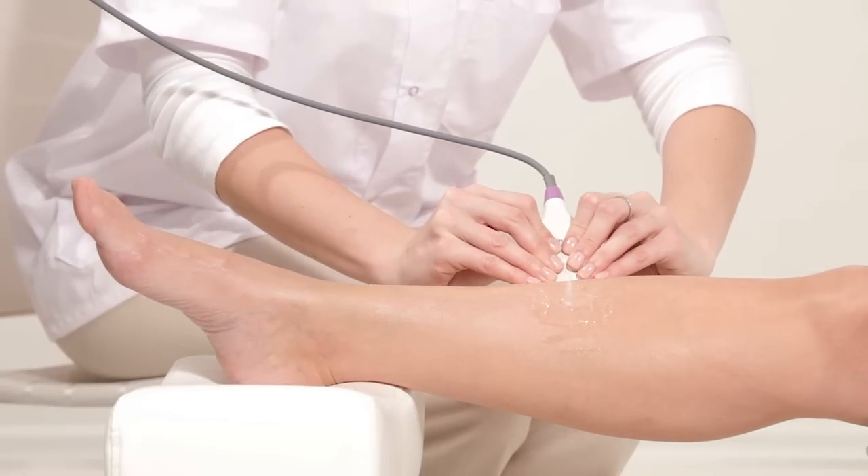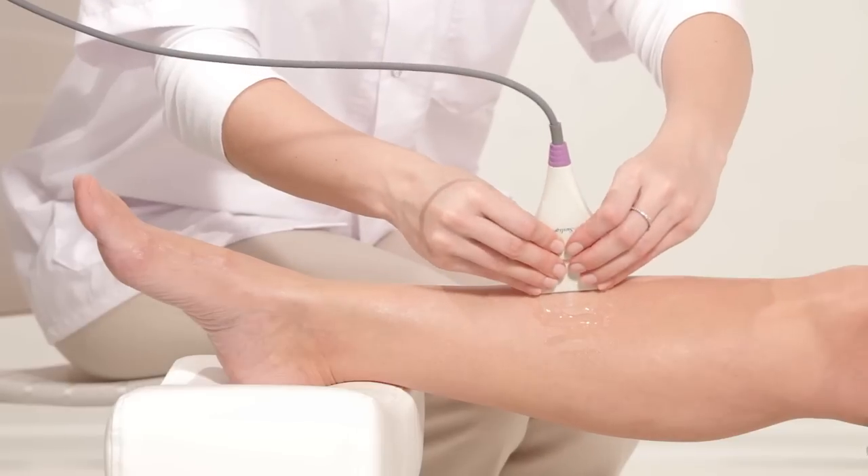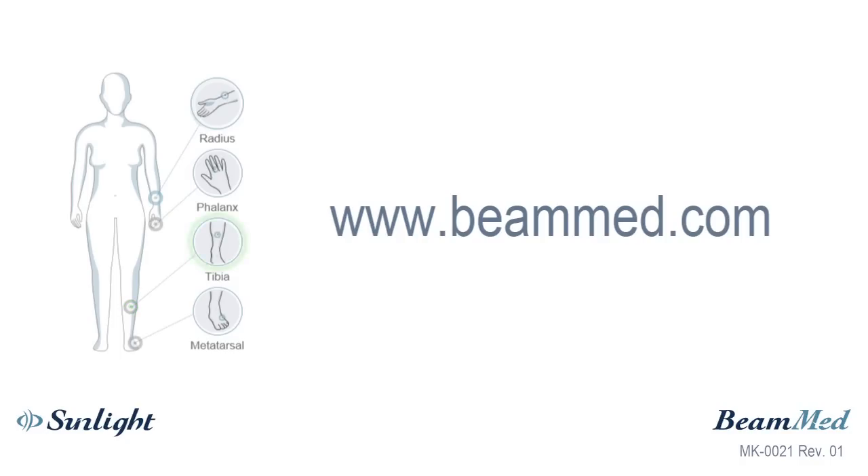If the information is insufficient, the system may prompt you to perform up to 2 extra cycles. For more information, visit the BeamMed website or contact your local dealer.